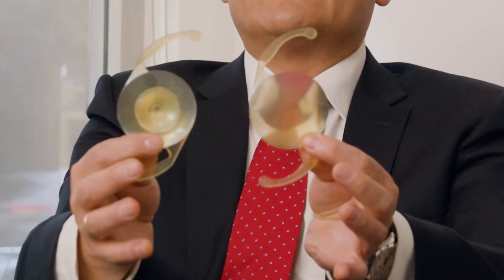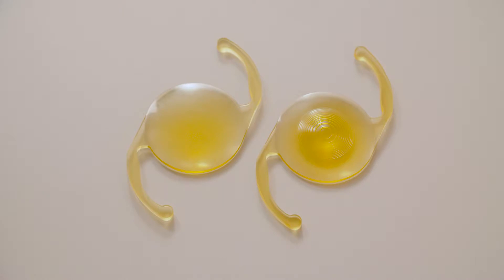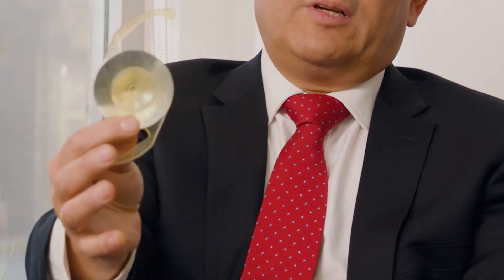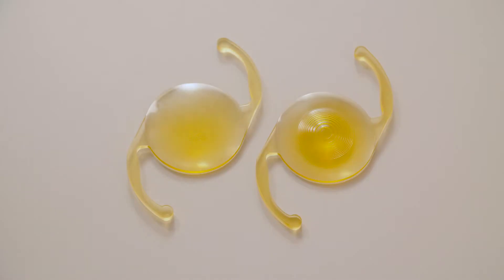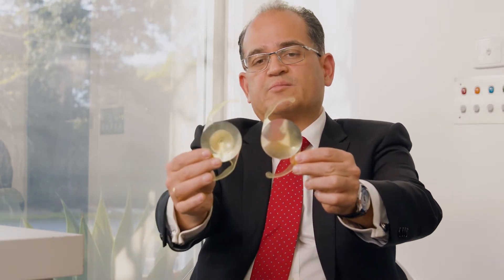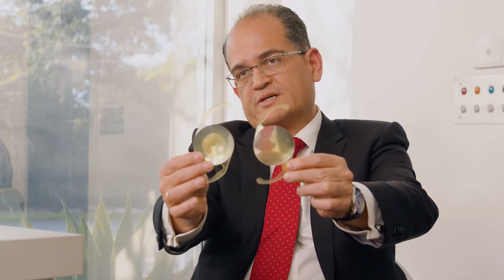Here I'm holding two lenses that are very similar, but you will see that this lens on my right has got little zones in the center. These zones confer the multifocal points used to achieve vision for near, intermediate, and distance. On the other hand, I've got another lens which does not have these zones — this is what we describe as a monofocal lens, which focuses light at one plane at the back of the eye. When you see the two lenses side by side, you can see the difference in the design.